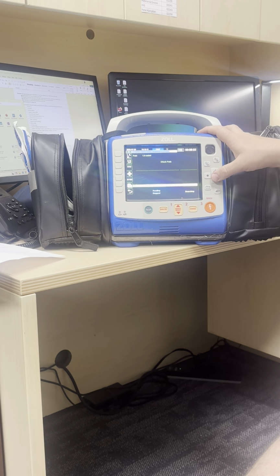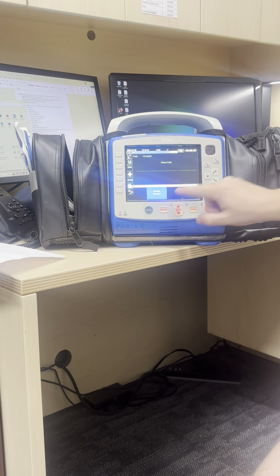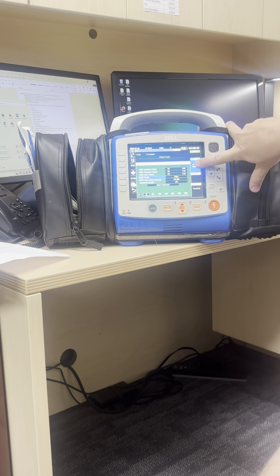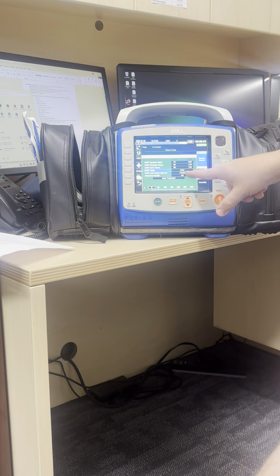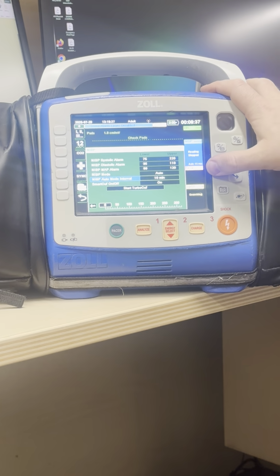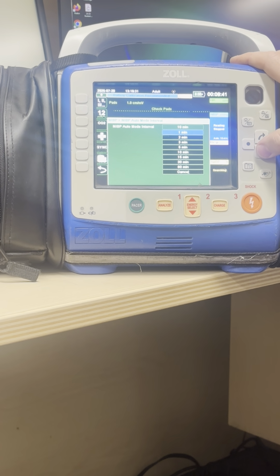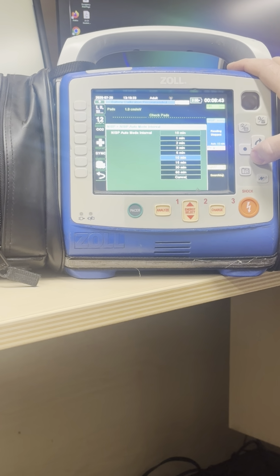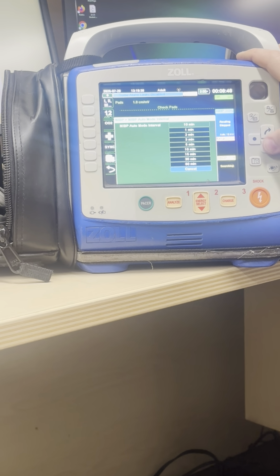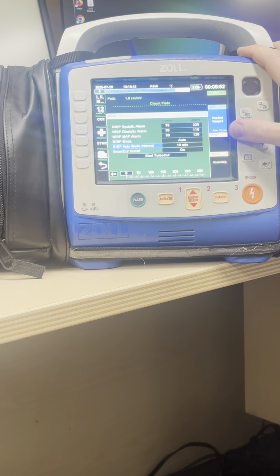Next, we will change the blood pressure cycle times. Continue cycling that blue selection around to the blood pressure field. Click on that. Once we get in here, it's got default alarm settings. It'll have the cuff mode automatically. You can change it to manual if you wish. Otherwise, automatic. And by clicking the interval, you have more time selections: 1, 2, 3, 5, 10, 15, 30, 60, or cancel. So the default is 10. You can change it to what you like.